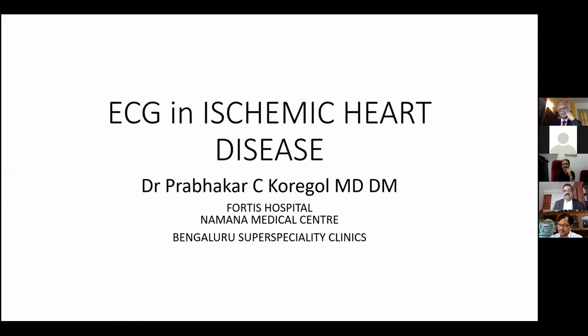There was somebody asking a question on the sensitivity of aVR elevation in left main stenosis. Various studies differ, but when you have an isolated aVR elevation with ST depression in multiple leads, the sensitivity is about 76 to 80%. Specificity is about 85%. But as a clinician, what you should know, apart from sensitivity and specificity, is the negative predictive value and the positive predictive value, which are more important for me as a clinician. If you had all attended our biostatistics class, that would make lots of sense. It has a positive predictive value of only 57%. So if you have 100 ECGs, only 57 of them are likely to be left main disease. And if it is absent, the negative predictive value is about 95%. Of course, this applies when the aVR ST elevation is not associated with other ECG abnormalities like RBBB. I think that answers the question, sir.